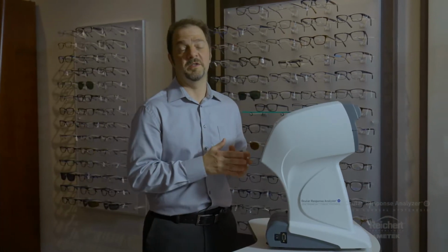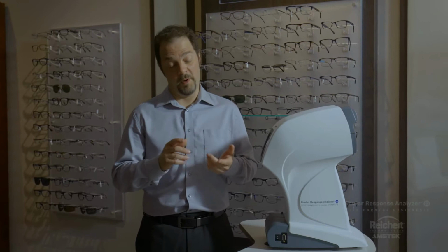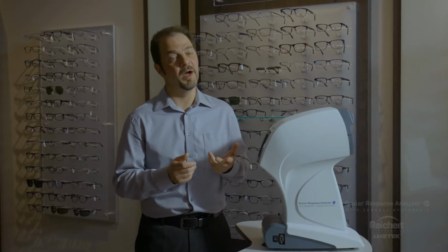Now, there's always going to be some examples where this device doesn't agree with the Goldmann, and it might be by a considerable amount. And that's usually attributed to perhaps postural changes in the patient. Don't forget, Goldmann is a very subjective method of tonometry. Two different Goldmann operators will give you two different answers as to what the pressure is in any particular patient's eye at the same point in time. When a patient moves positions, changes rooms, there's lots of different variables that come into play here, lots of opportunity for actual pressure changes to occur.